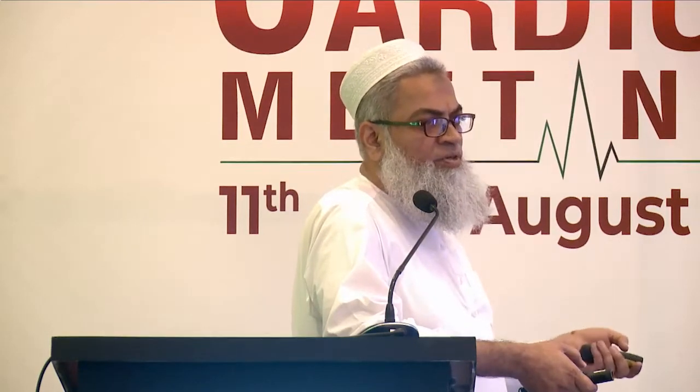And just to confirm, we injected and we were in the pericardium. And I think that you don't have to worry about it. Just leave, don't do anything, just stitch it and shift the patient for the surgery. Some other people may think of closing with the device, but this patient is already needing a mitral commissurotomy. You have already got tamponade. So we shifted the patient to the theater, and the patient was done safely.